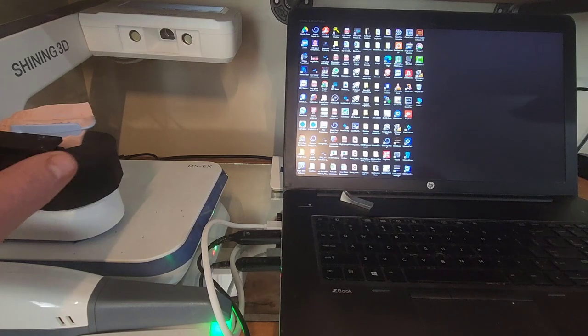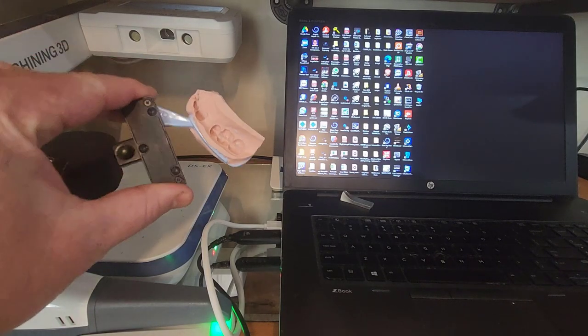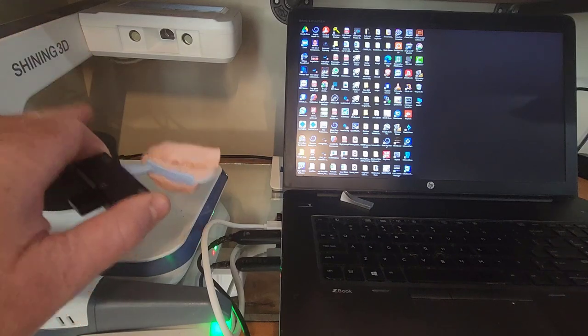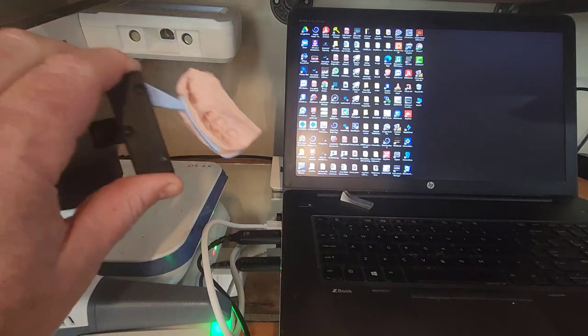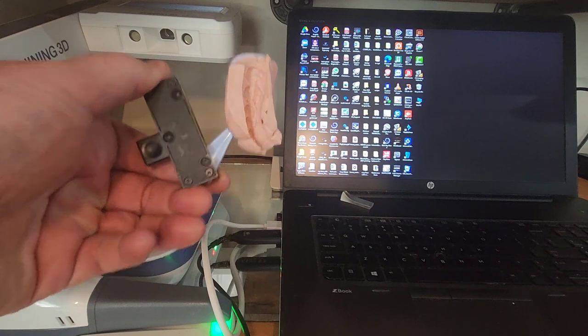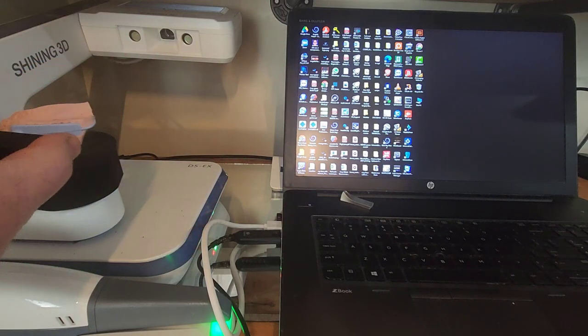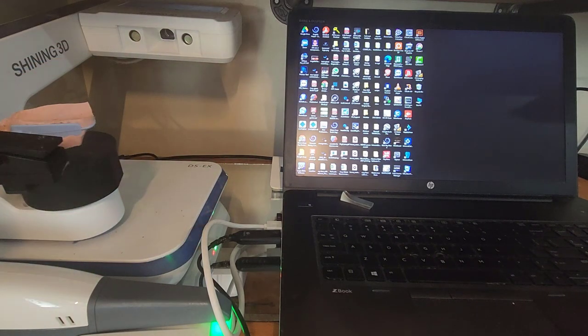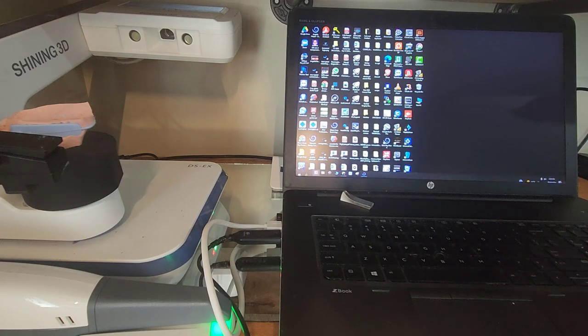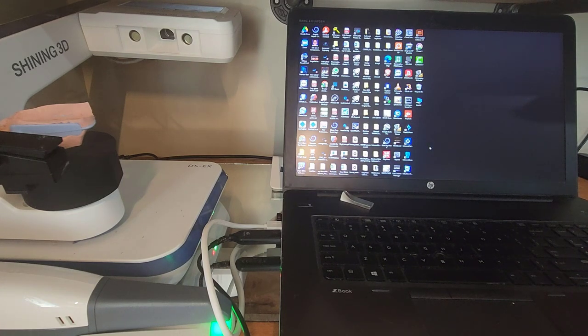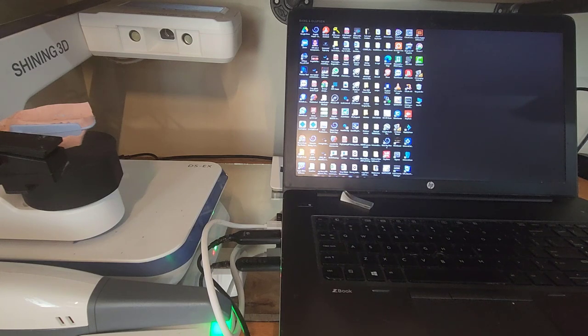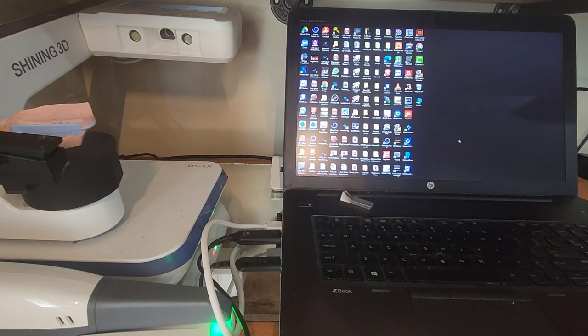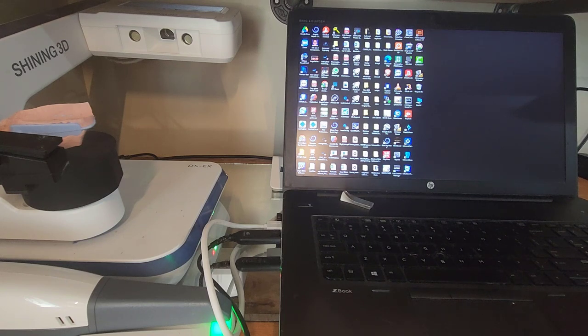Hey, this is Dr. Corey Glenn. I'm going to be showing today how to use the Shining 3D DSEX Pro scanner to scan this triple tray. So this is actually for a guided surgery. The doctor, to generate their STLs, just took a simple triple tray impression. And so we're going to scan that with the scanner, generate the STLs, and then we'll pull that into Blue Sky Plan to generate the surgical guide.